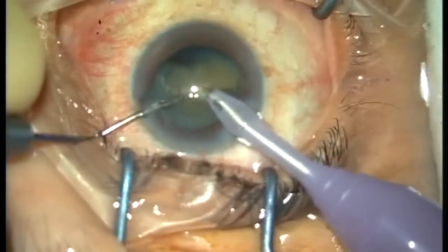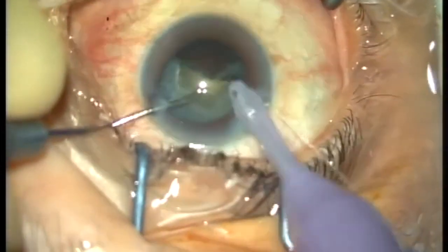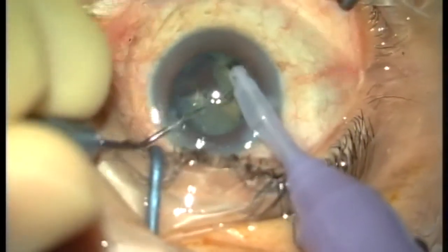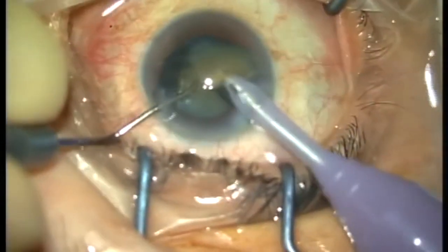Again in this situation, we set the vacuum at linear mode with 400 mmHg suction, and torsional at 80%. A similar method was repeated for the subsequent quadrant. Again, we usually set the bottle height to be high as the eyeball was pretty short.